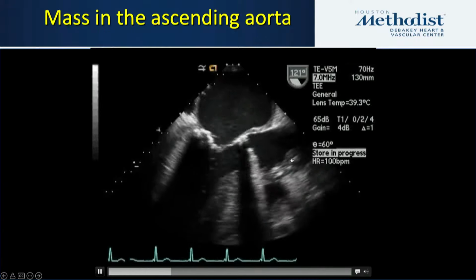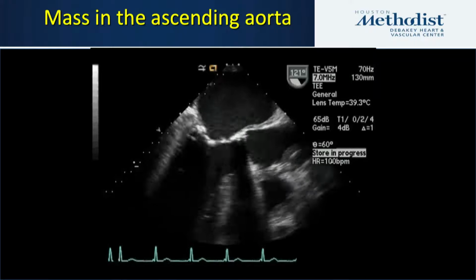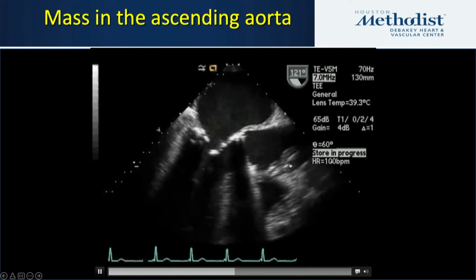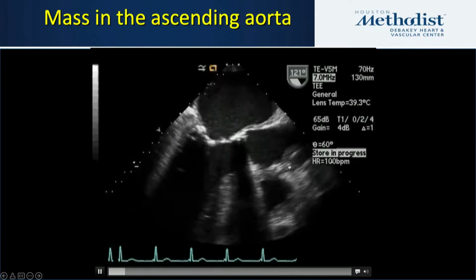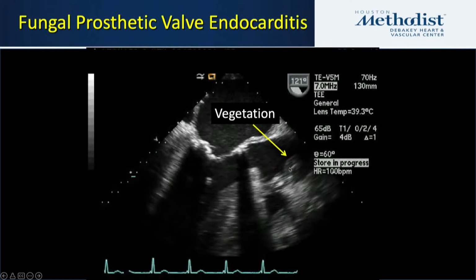And if you look just a little further up right here in the proximal ascending aorta, you see a different sort of wiggling gelatinous mass that's attached here. Remember, this is a TEE, and this was actually the site of the surgical aortotomy and the suture, and this ended up being a fungal vegetation attached to the aortotomy site just distal to the prosthesis. So another reason for this patient's poor health.